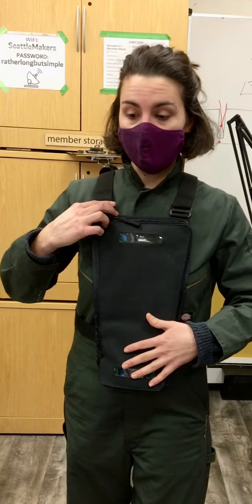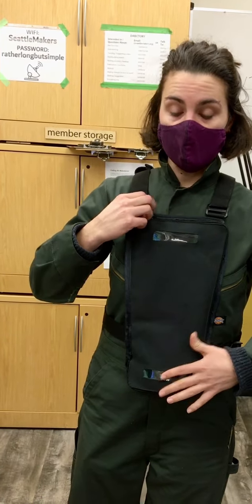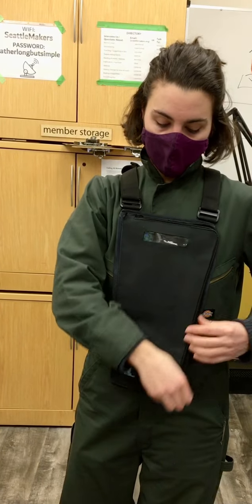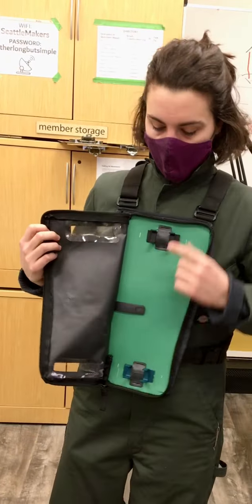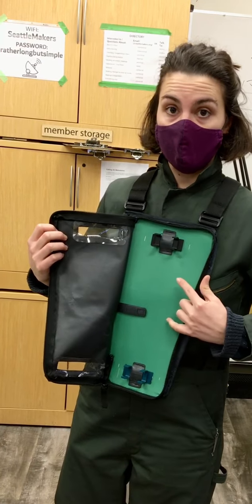With this particular system, we're going to have a sensor at the top and at the chest. You can see inside, we've 3D printed two mounts that each of those sensors will clip into.